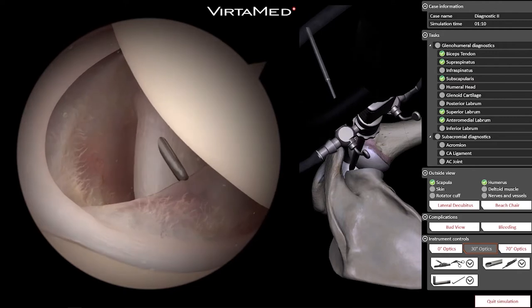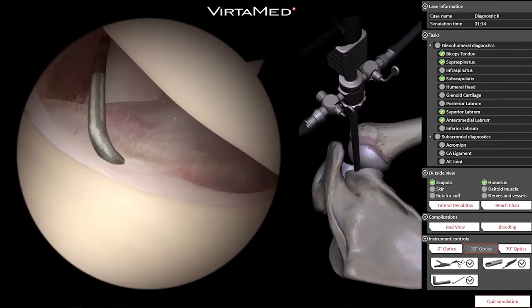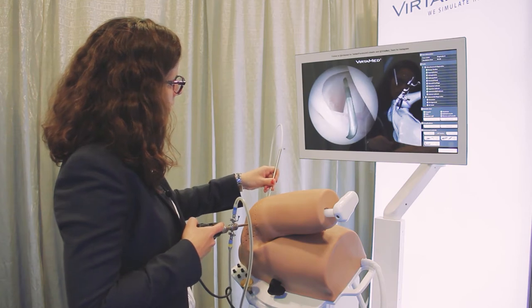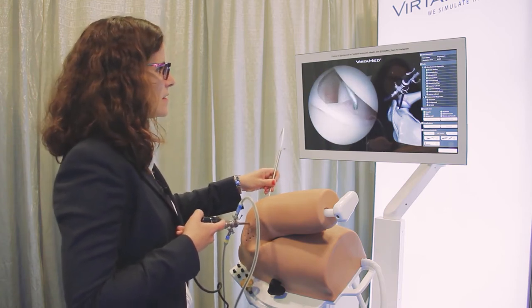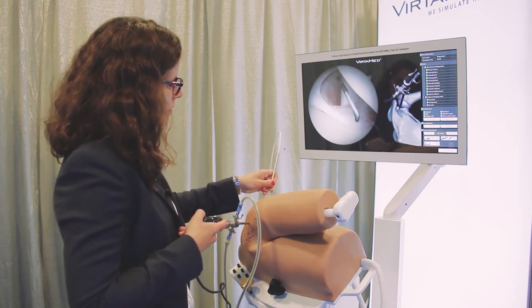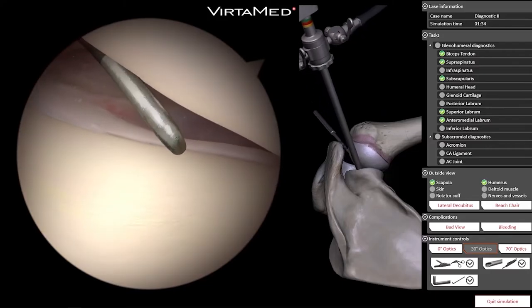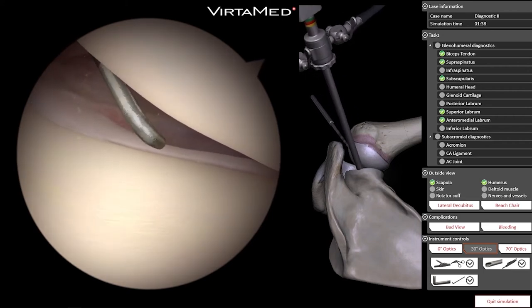The probe is right through the subscap there, and we can see the labrum. The simulator is great but doesn't necessarily completely replicate what you'd see intraoperatively. The labrum here feels a little bit loose. We're now seeing the most inferior aspect of the labrum — you can see the humeral head is above us and the glenoid is below us.